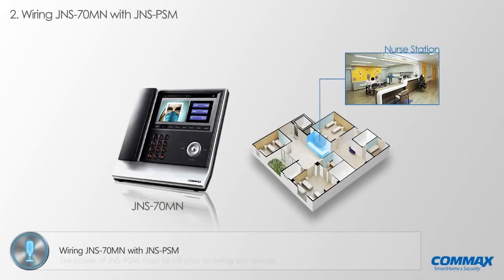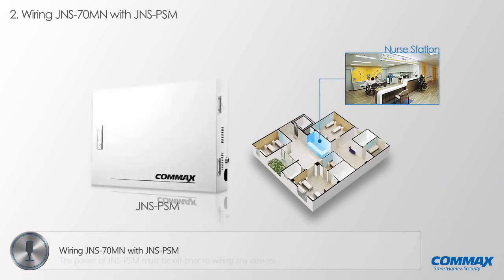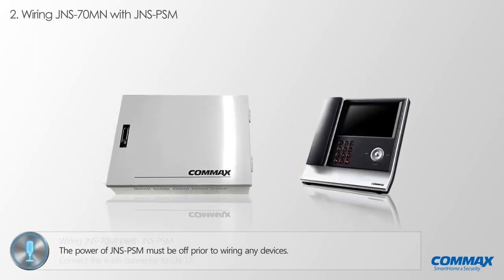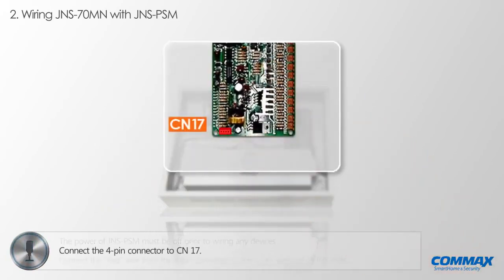We'd like to show you how to connect JNS 70MN to JNS PSM. Please make sure the power of JNS PSM is off before connecting any devices. First, connect the 4-pin connector to CN17.